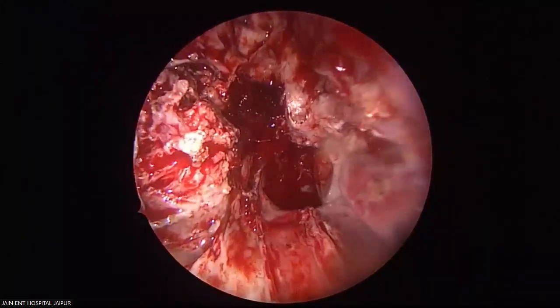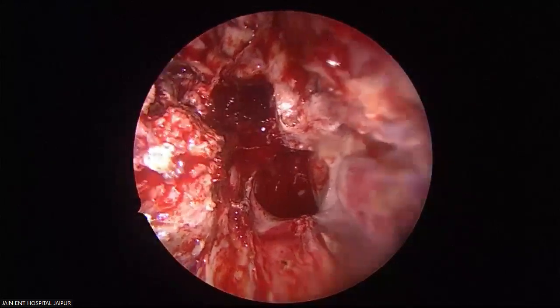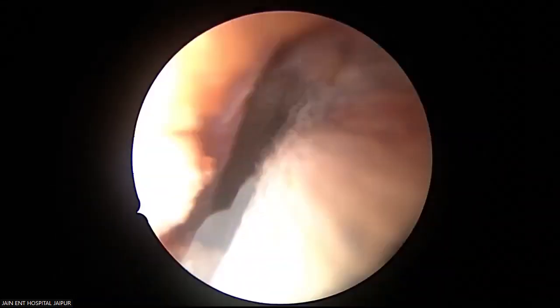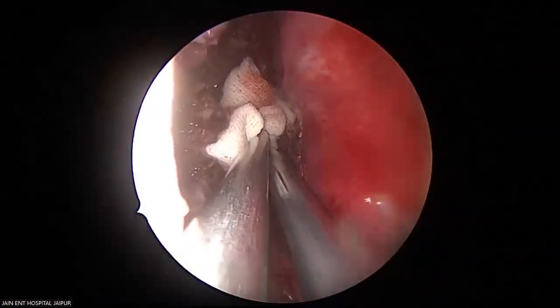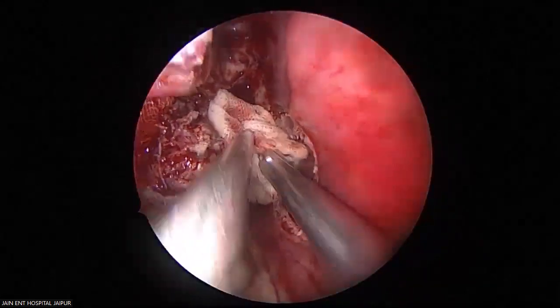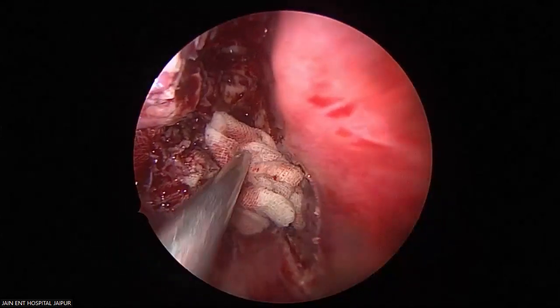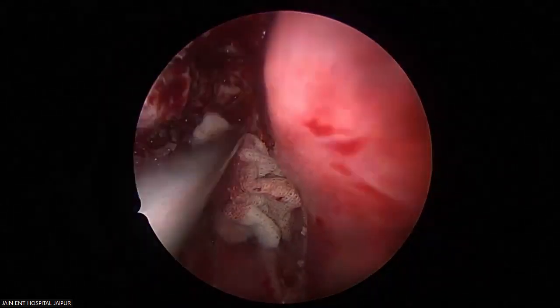Surgicel is so good. What an excellent tool on the soft tissue surfaces. Just pack with the Surgicel and press on with the gauze piece. See, everything, no bleeding. Yeah.